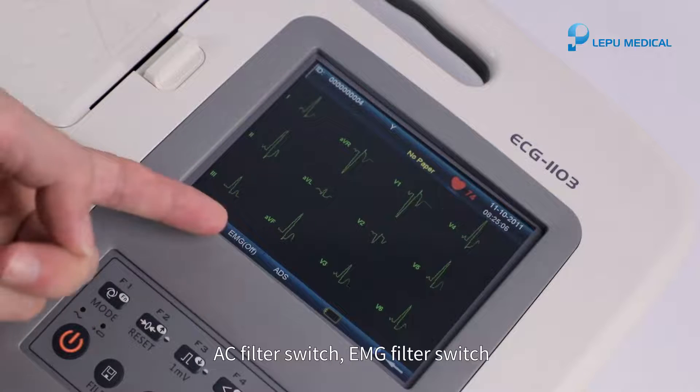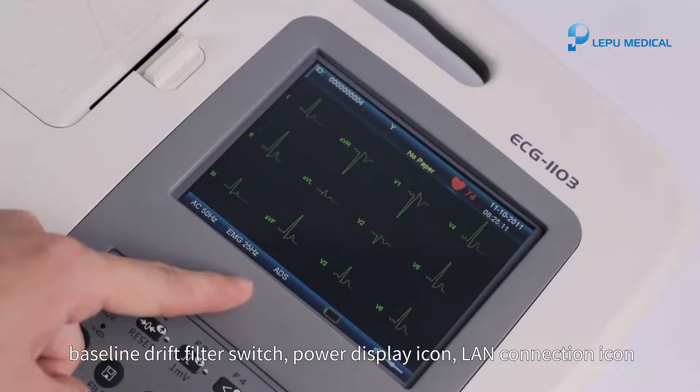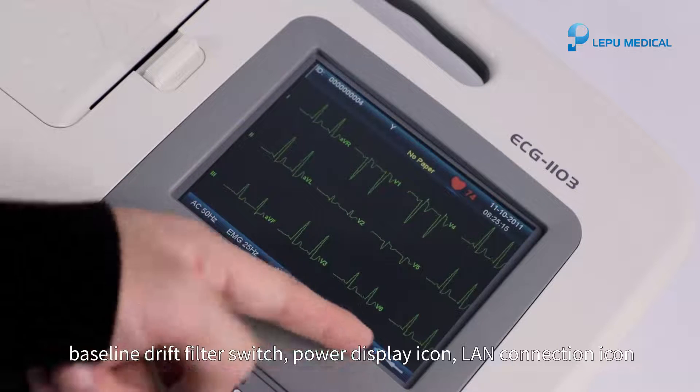AC filter switch. EMG filter switch. Baseline drift filter switch. Power display icon. LAN connection icon.